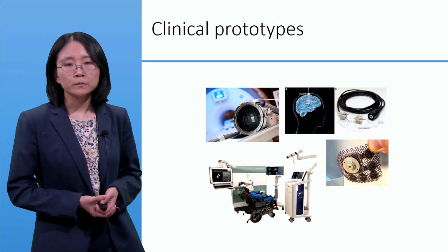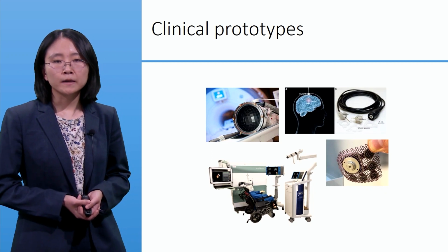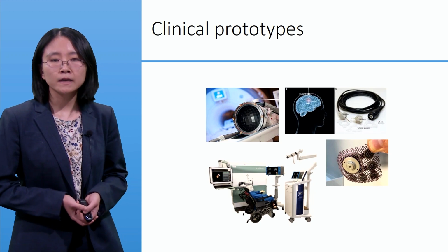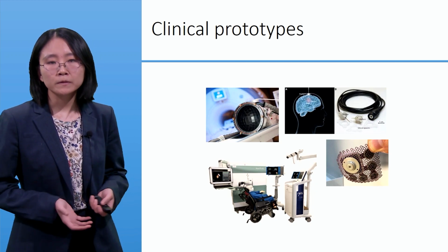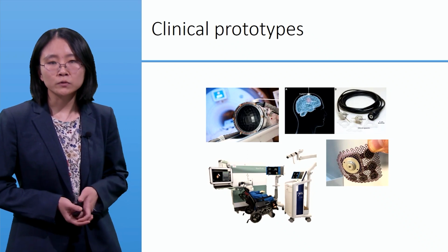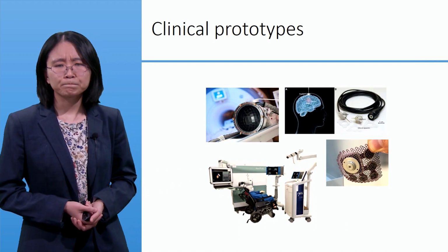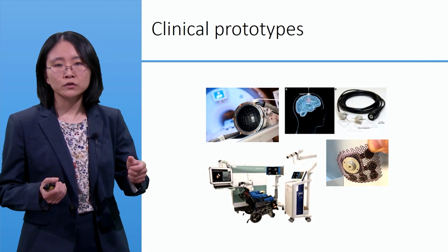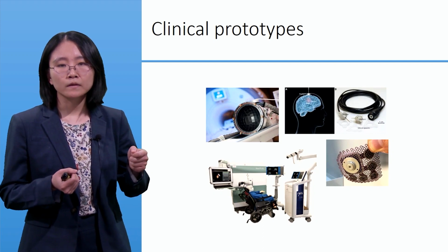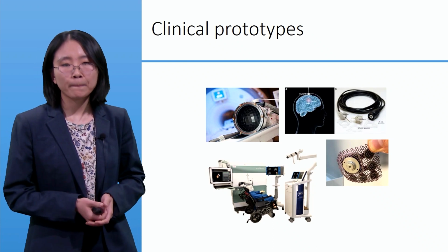And then on the bottom is another type of transcranial transducer, but in this case it is not coupled to an MRI, therefore improving its portability, but is coupled to a neuronavigation module on its right, that allows the operator to move the transducer such that it could target the area that is desired.